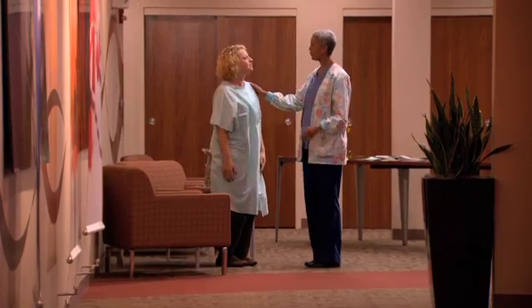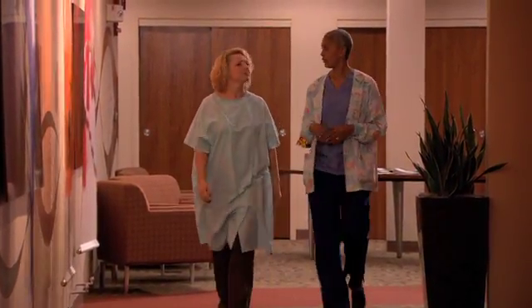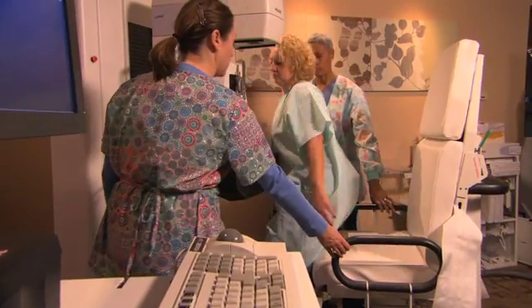Of course it's okay to be nervous about any medical procedure. But it's really not quite as scary as it sounds, and it helps to know ahead of time what's going to happen.